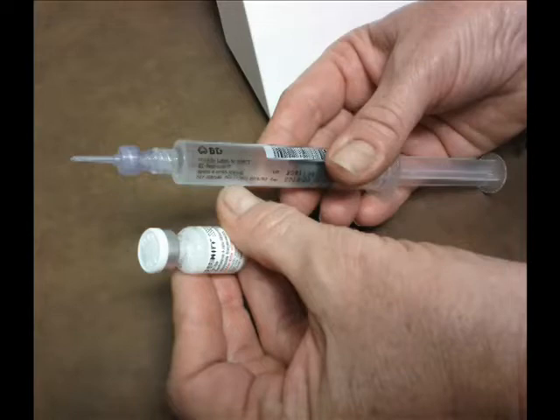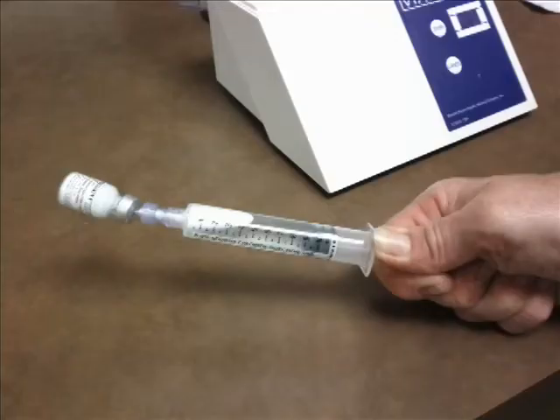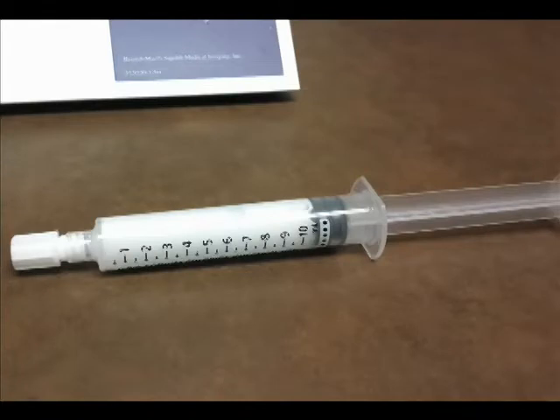Here we use Definity Contrast, which is a single-use vial with 1.5 milliliters of contrast, which is activated via a specific mixer. The contrast vial is placed on the agitator device and agitated for the time specified by the manufacturer. The amount of saline in the syringe is adjusted to 8.5 milliliters, and the included device for withdrawing the contrast from the vial is used to add the contrast to the saline-filled syringe. The opaque contrast agent is now ready for intravenous injection in increments as needed to achieve a contrast effect.